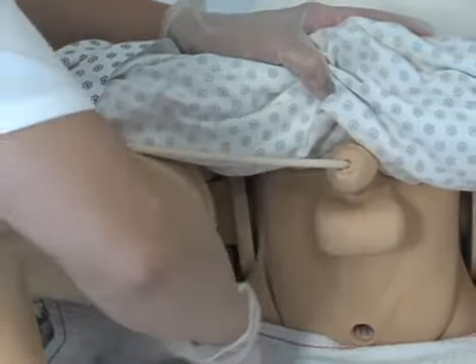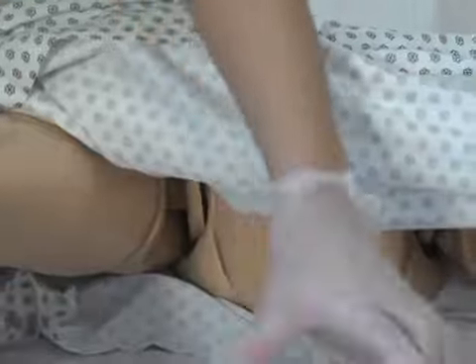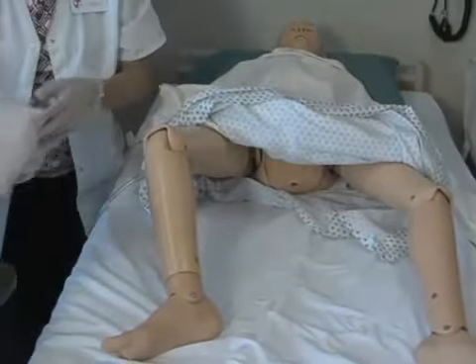care. Okay, now that my patient is done with this procedure, I'm going to remove my incontinence pad and place it in a dirty linen.